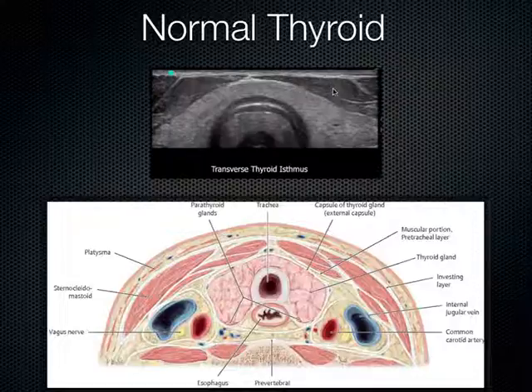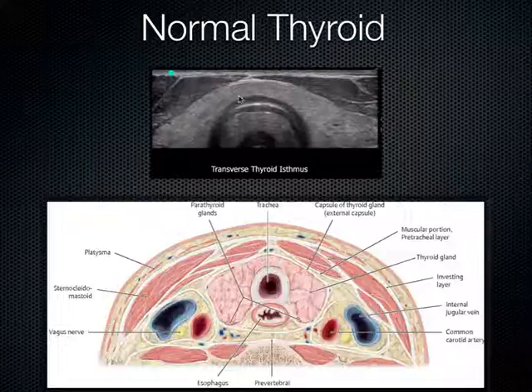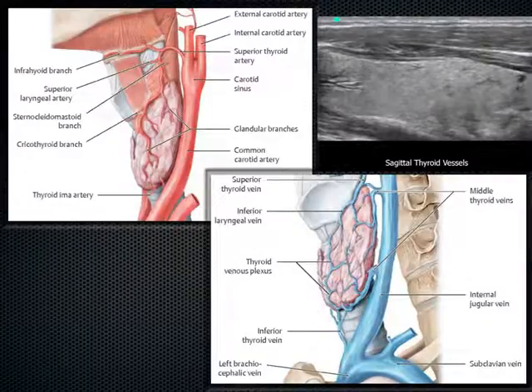We can see those muscles up here. The thyroid should have a very nice isoechoic texture to it, somewhat hyperechoic and isoechoic. It looks, for all intents and purposes, almost exactly like the testicle tissue. Same sort of glandular looking appearance here. This is a sagittal view of the thyroid. We can see some of the vasculature poking through it, and we can see its nice isoechoic texture.